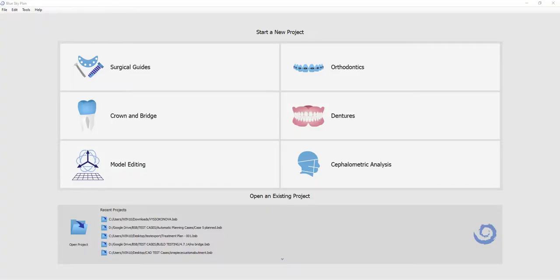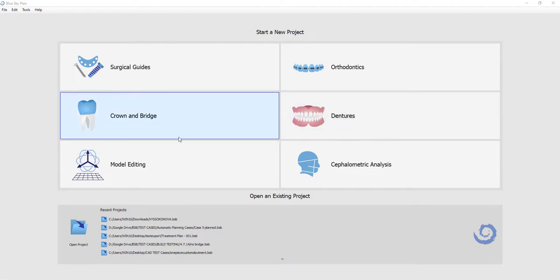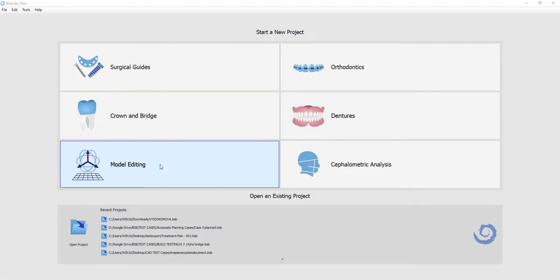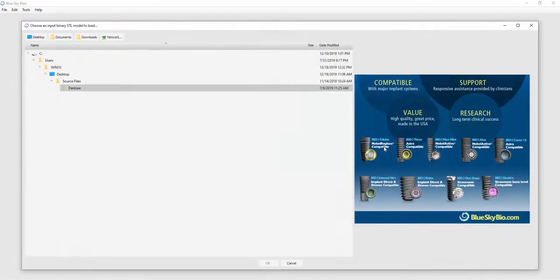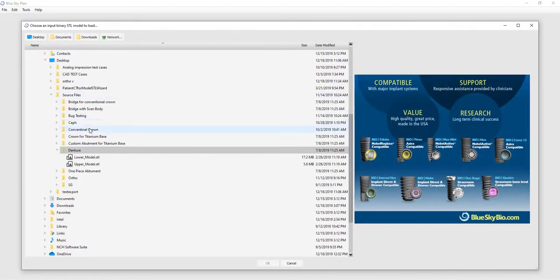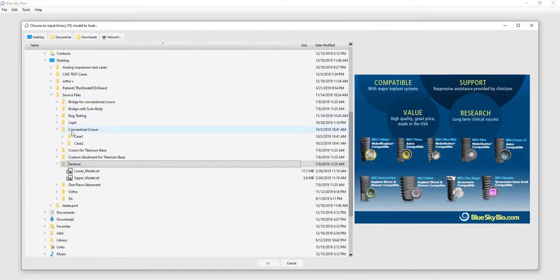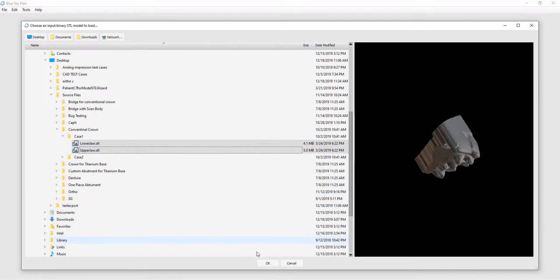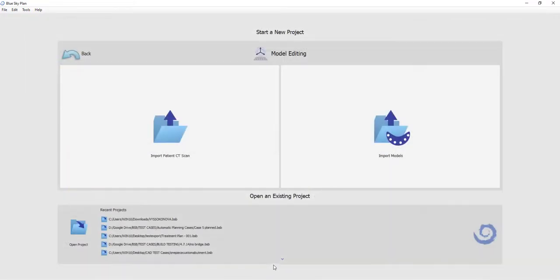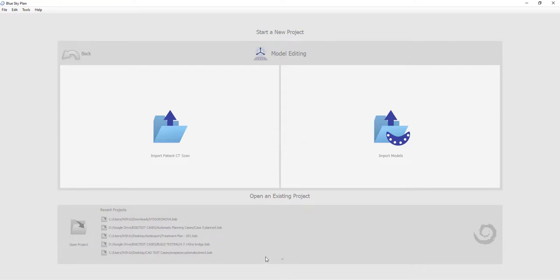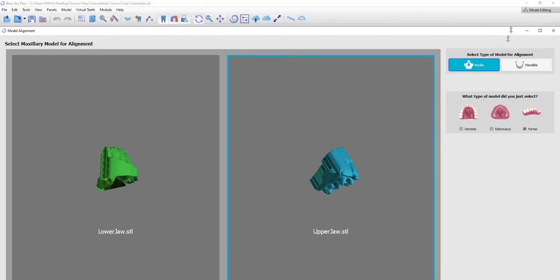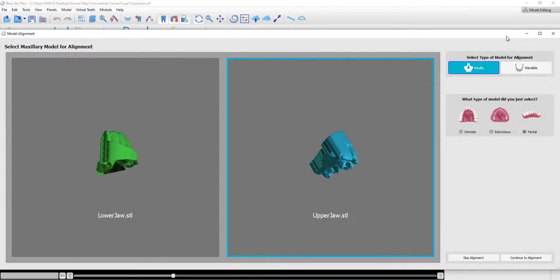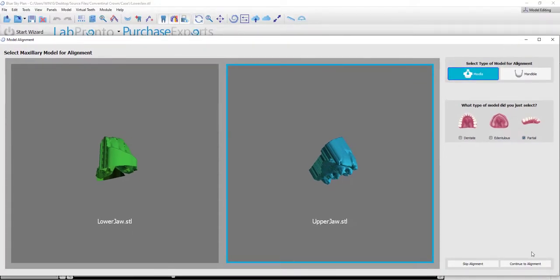Importing and orienting partial arches as well as dentate arches follows a very similar process. Let's take a look at the processes now. Multi-selecting the relevant files. And here we are looking at partial arches. I'm going to select the upper arch, select maxilla and partial, and continue to alignment.